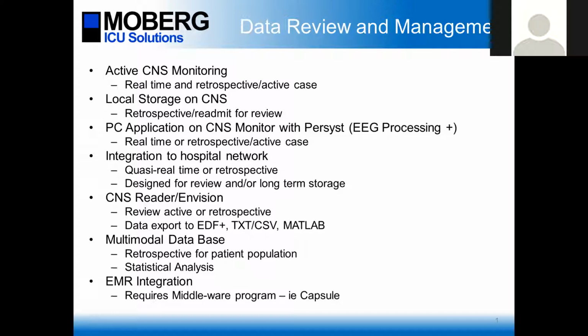This is not something that just automatically comes along with the CNS monitor. But those who used it during its beta testing phases and those who are purchasing it now have found that it is extremely valuable. What the Reader does is it gives us a way to review data actively, so we can look directly at what's on the CNS monitor from a remote location. It can be on a desktop or iPad, or it can be for retrospective review. It's really just a software program that can get uploaded to a tablet or a computer and can be used. For that type of data review, that happens pretty much automatically.